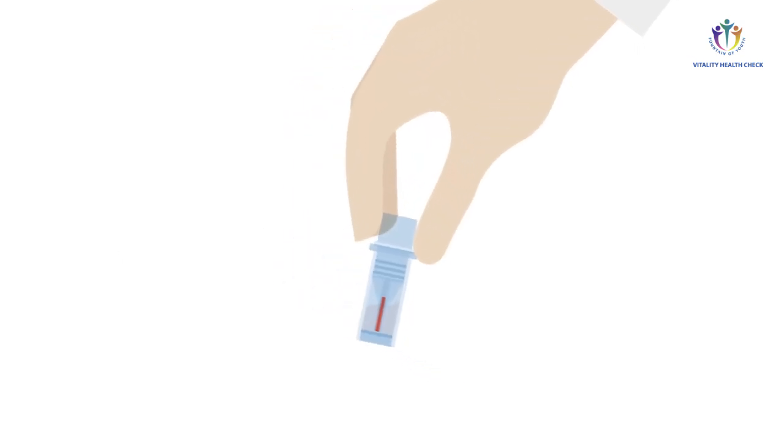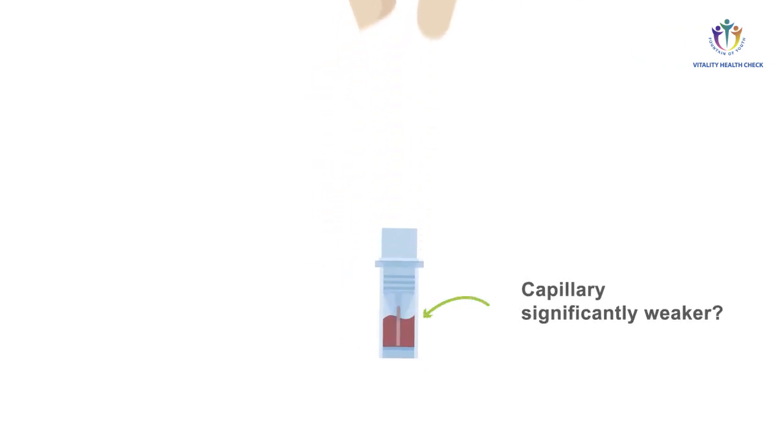Always check your result in transmitted light. The centrifugal force must pull the sample out of the capillary and into the sample buffer before it absorbs liquid again. Complete mixing is achieved once the liquid in the capillary appears to be stained weaker than the pre-mix at the bottom of the collection tube in translucent light.